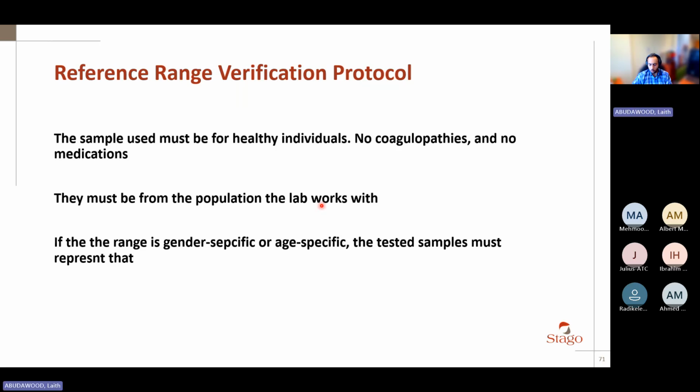Now, briefly, as you know, a reference range usually represents people who are healthy, who are normal, who do not have any diseases. So it follows that normally healthy people are selected for this range calculation. I would not, for example, choose cancer patients to calculate my reference ranges, because cancer patients do not represent a healthy population. I cannot conceivably use unhealthy people to calculate reference ranges that will tell me a result is healthy. This is quite obvious, no need to discuss it any further.